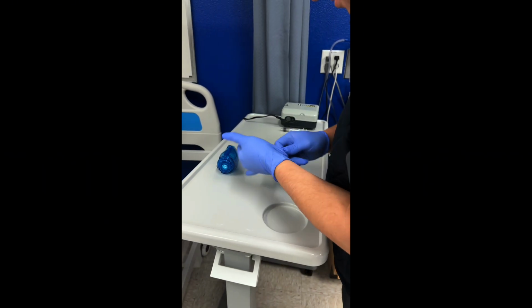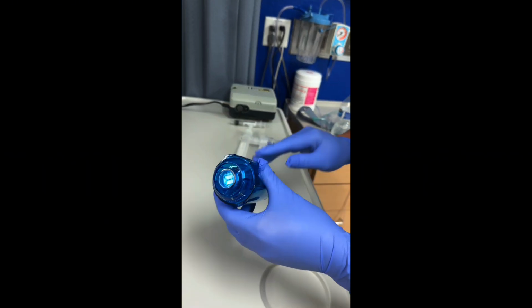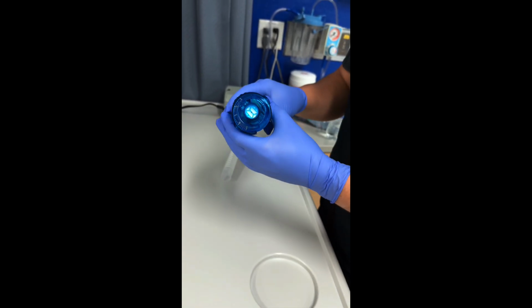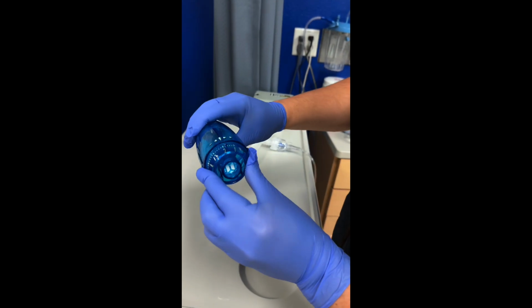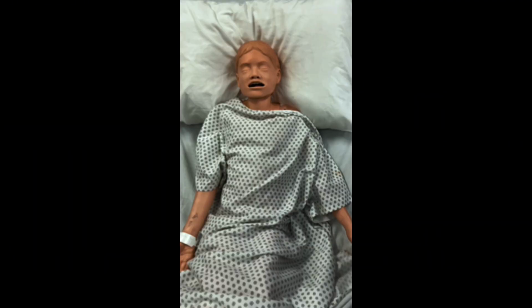First, I ensure the Acapella device is clean, intact, and properly assembled, with the mouthpiece securely attached. Next, I adjust the resistance dial to a lower setting to begin. This allows me to assess the patient's tolerance and expiratory flow. The patient is positioned upright, either sitting in a chair or in a bed, as we see, to allow for optimal lung expansion.